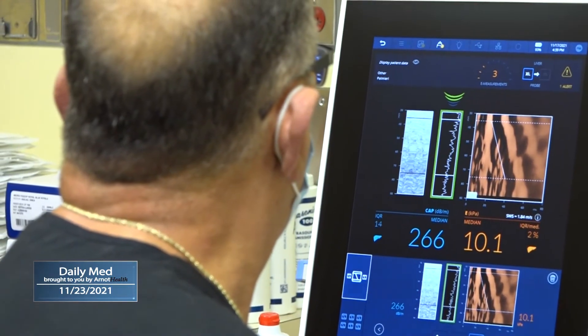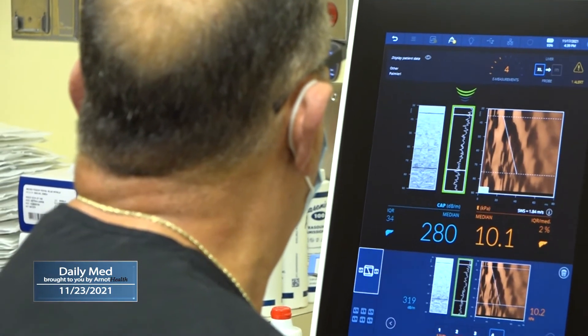I'm specifically looking at degree of fatty infiltration of the liver, as well as degree of fibrosis or scarring of the liver if it's present — something otherwise seen in a more invasive procedure, like a liver biopsy.